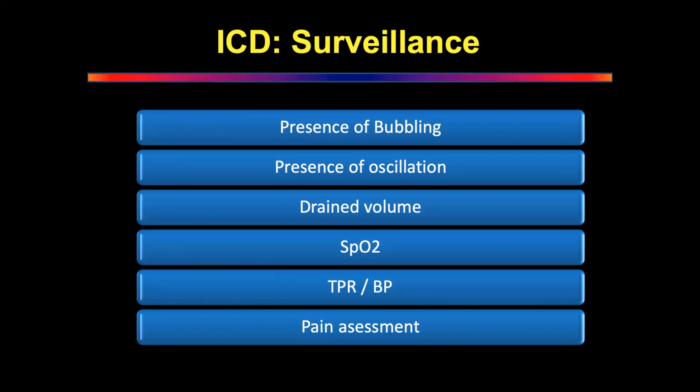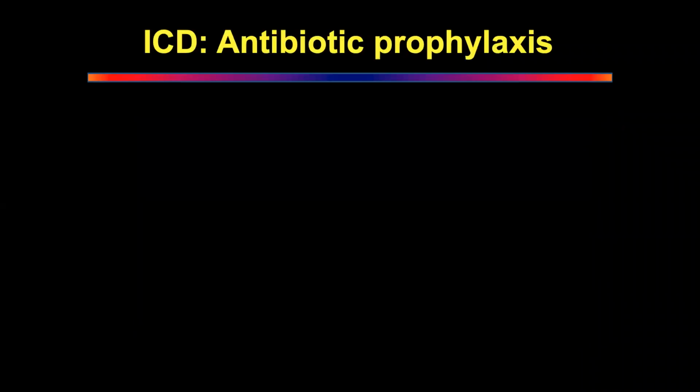Okay, so besides looking at the drain, don't forget the patient. That's the point I'm trying to make. Look at the TPR, BP, saturation, and pain assessment. Okay. This is what I want to hear in the exam. Thank you.